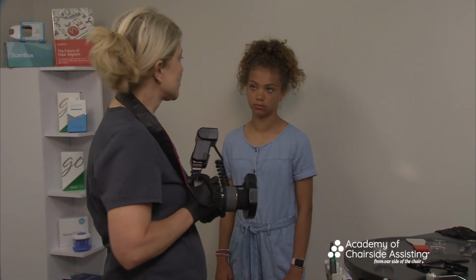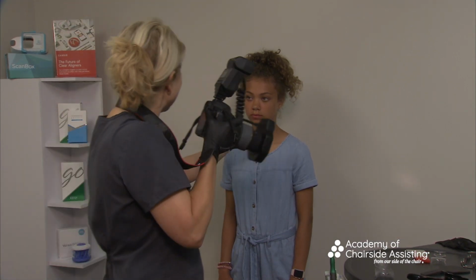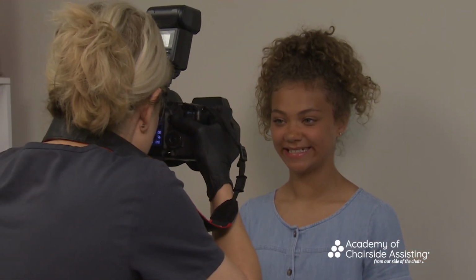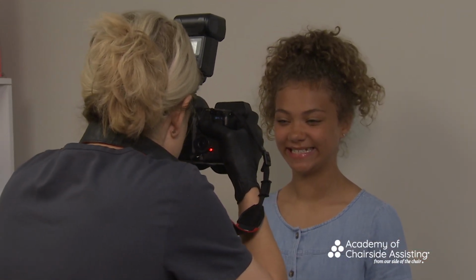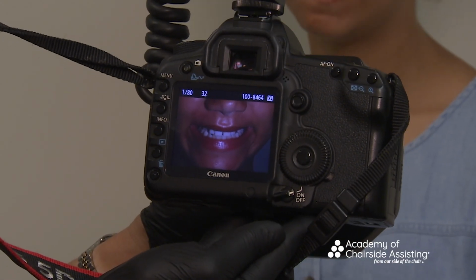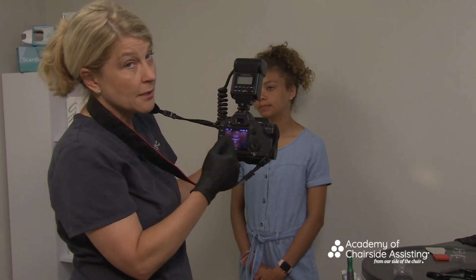I love that. So Kylie, I want you to look at me, and again, love that head tilt, girlfriend. All right, so Kylie, what I want you to do is just say, ee. There we go. And sometimes you'll say, well, it doesn't really look any different than the smile shot, but you'll be surprised on some of those patients, the difference. Notice too, I'm dead in the center. Sometimes we can move and we'll be off. You don't want that. We want the same distance in the corner of the smile, same distance over here.